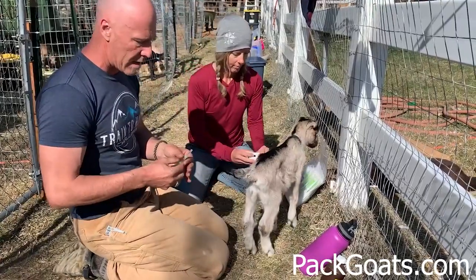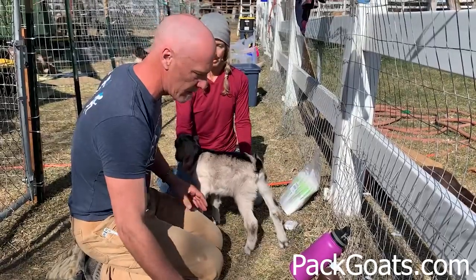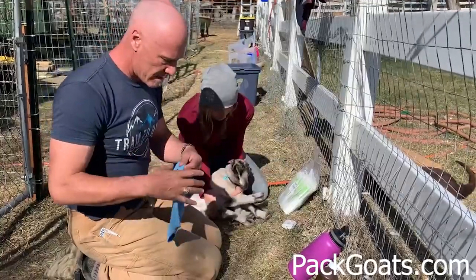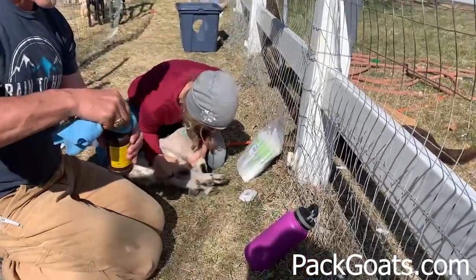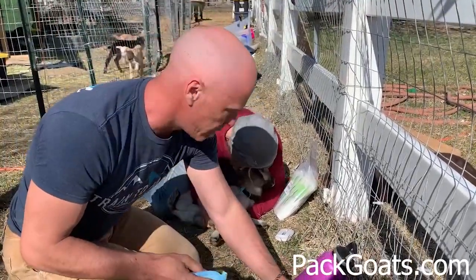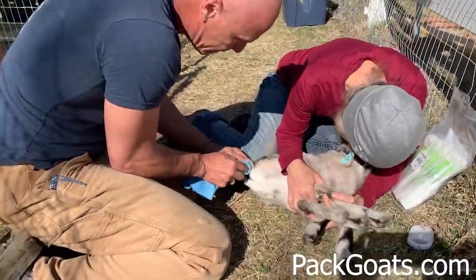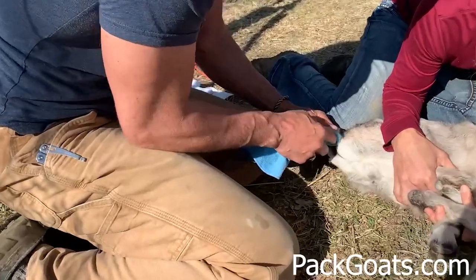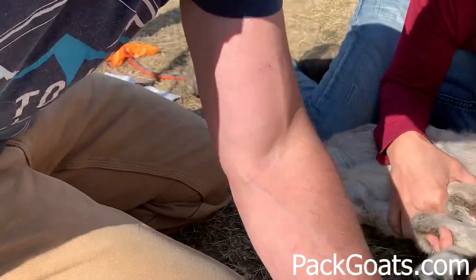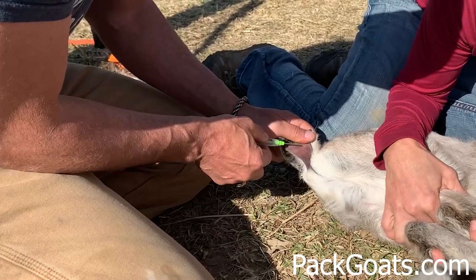So Christy's going to hold him down. We're going to iodine, then we're going to read — did you already read this one? Okay, sweet. Go ahead and hold him down the way we've been doing it. Get my little iodine. This goat is about a week old, it's kind of easier when they're easier to wrestle. I'm just going to go in and iodine this section. Some have bled, some have not — most have not. So we'll see how this little guy goes. I'm going to pull the webbing to the side so I'm not into the meat, just under the skin.